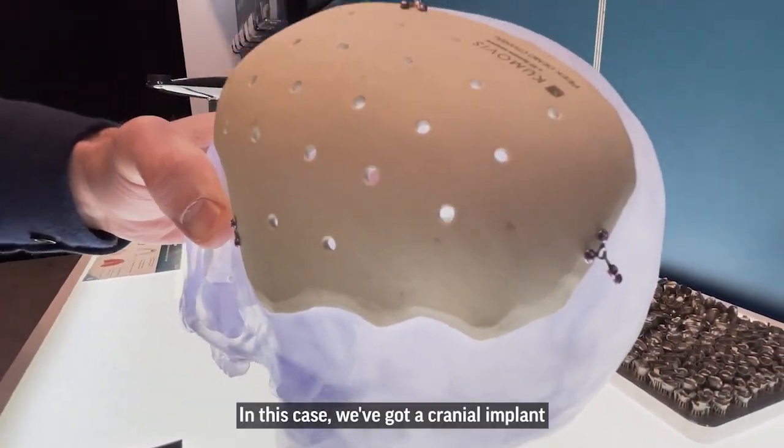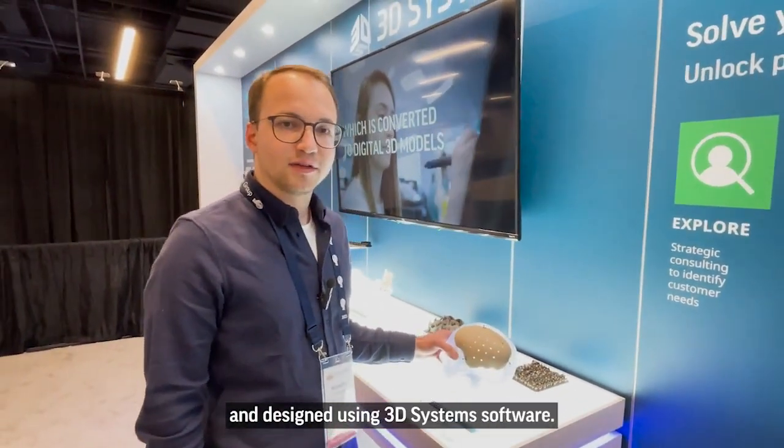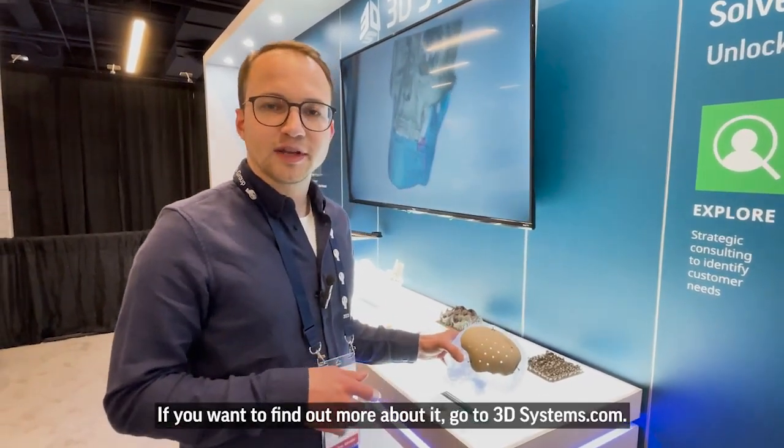In this case we've got a cranial implant printed with implant grade PEEK and designed using 3D Systems software. If you want to find out more about it, go to 3DSystems.com.